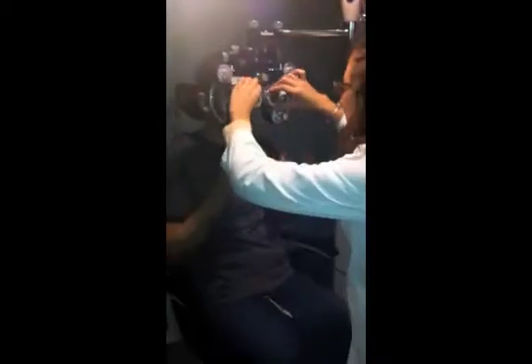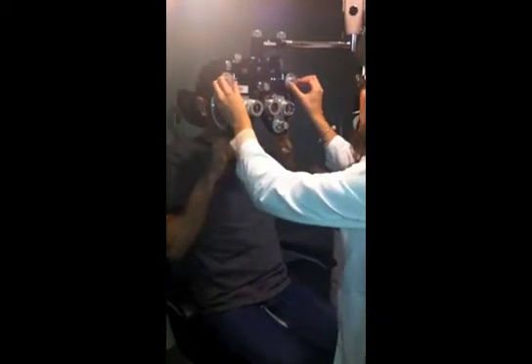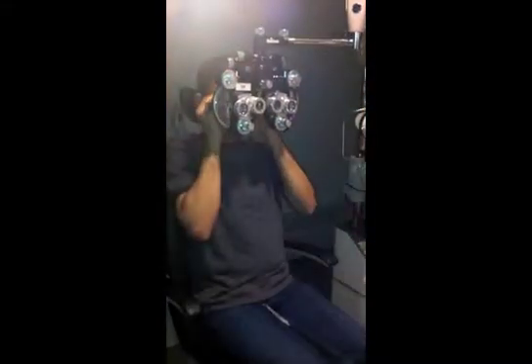What do you have to do? It's a tripod. It's pretty good. Alrighty, here we go. We're just going to keep refining and balance the prescription between both your eyes, okay?